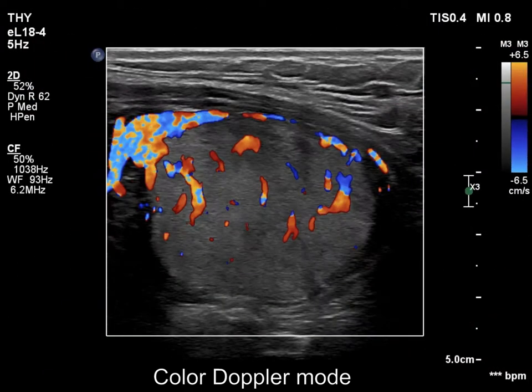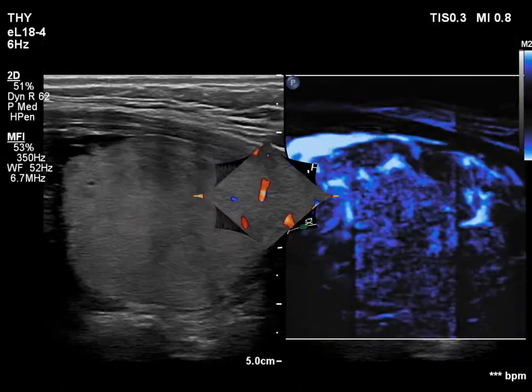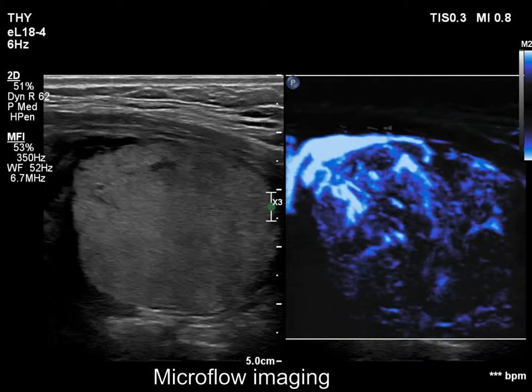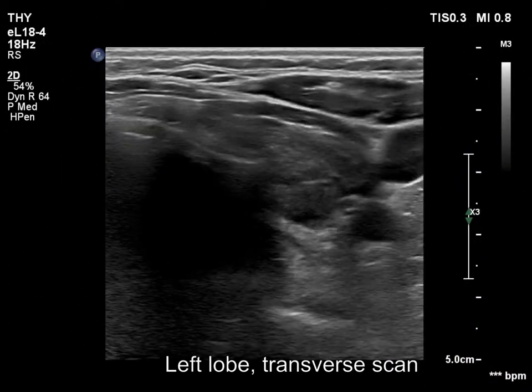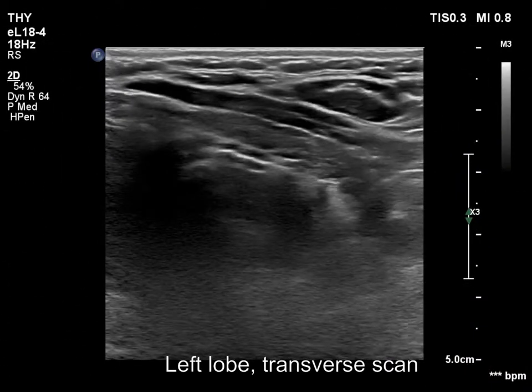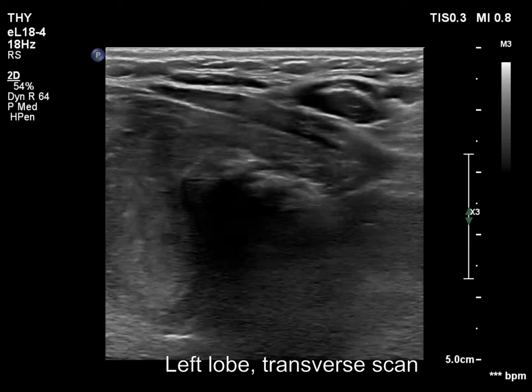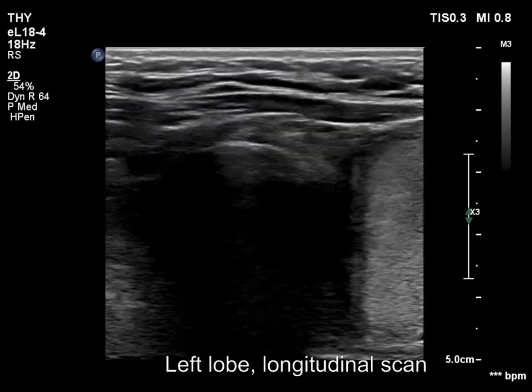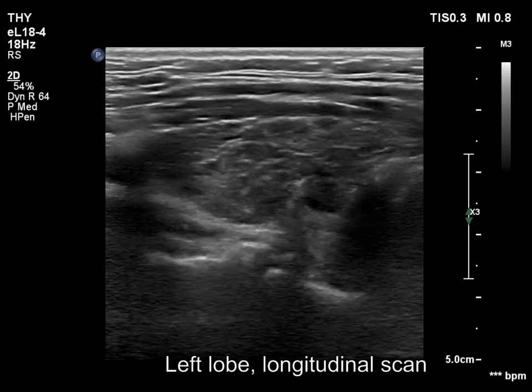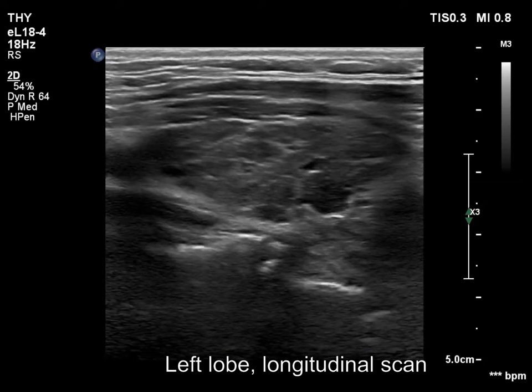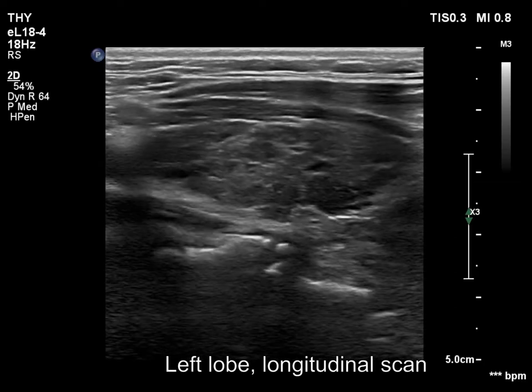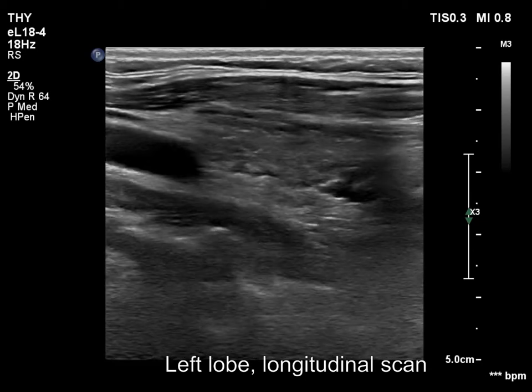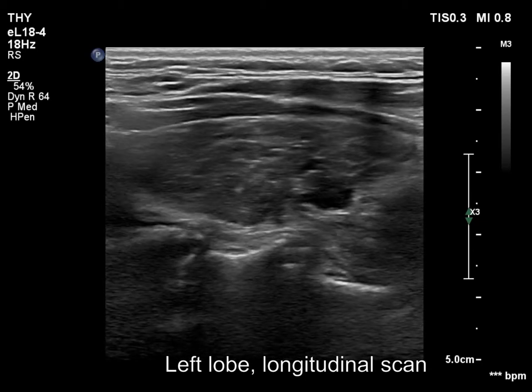The nodule shows paranodular and intranodular vascularity and is relatively rich in vessels. The left lobe has a similar appearance, also hypoechoic and inhomogeneous. This lobe has tiny cystic and deeply hypoechoic areas, none of which corresponds to a true nodule.